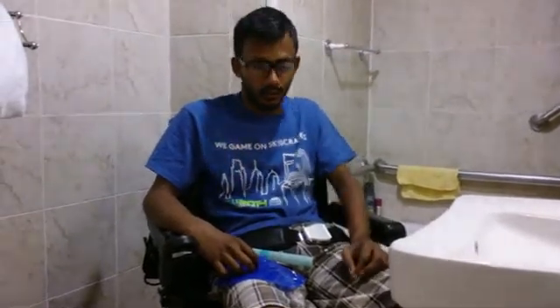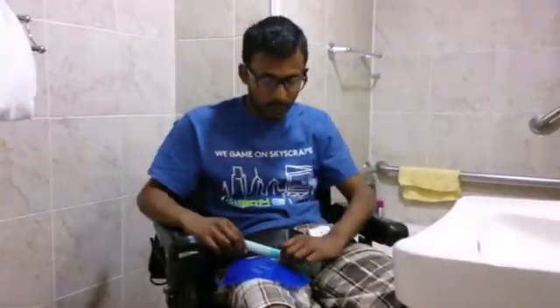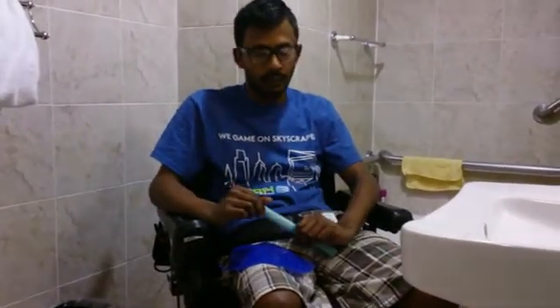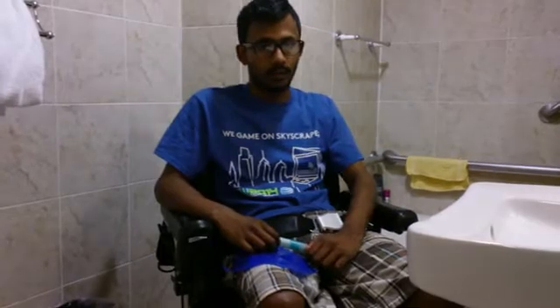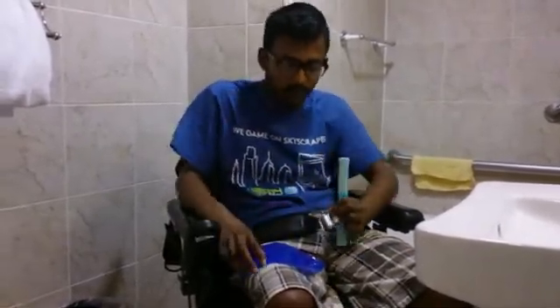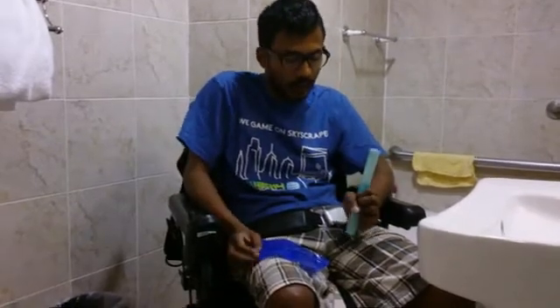Hi, I'm a C5/C6 quadriplegic and today I'm going to demonstrate how I open my catheter for a self-cath, for scivideoblog.com. I use a speedy catheter, and it looks like this.